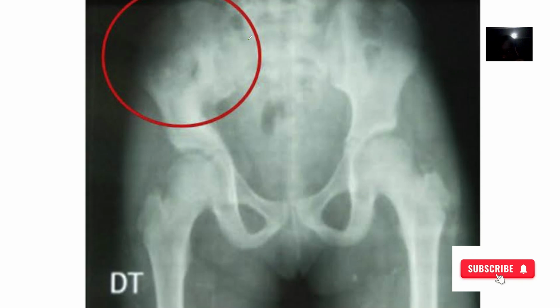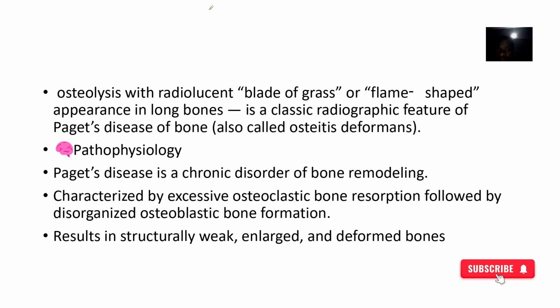So osteolysis. Anytime you hear lysis, of course, they are talking about something being chopped off, eaten away. So we said that it's a classic radiographic feature of Paget's disease of the bone, also known as osteitis deformans.